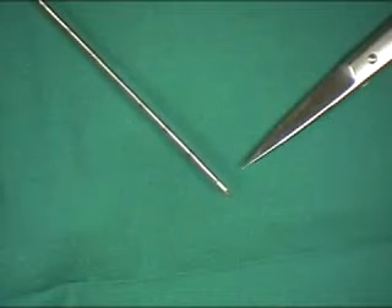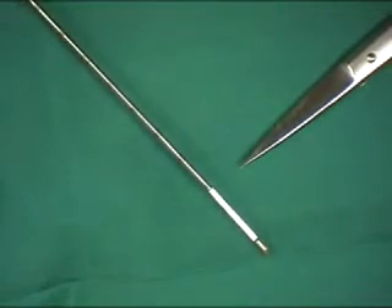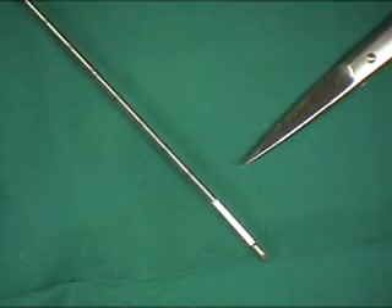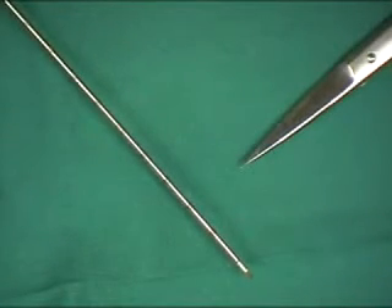The Tru-Cut needle is inserted and the central section advanced. The outer core is then pushed forward whilst holding the needle in place to create the core biopsy. The entire needle is then carefully withdrawn.